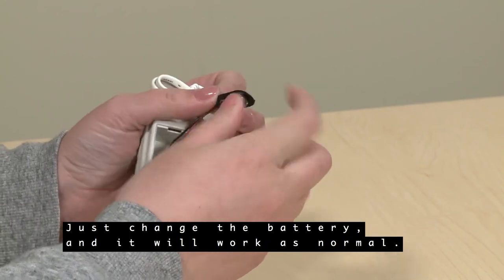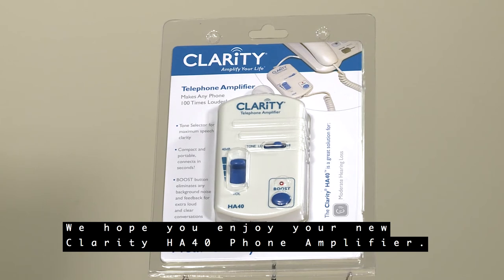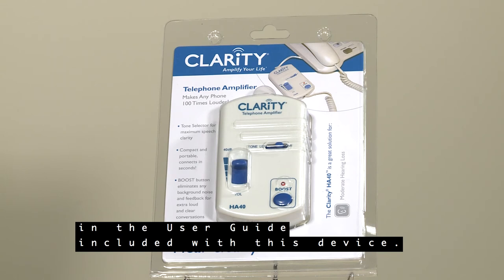Just change the battery and it will work as normal. We hope you enjoy your new Clarity HA40 phone amplifier. You can find all these instructions in the user guide included with this device.